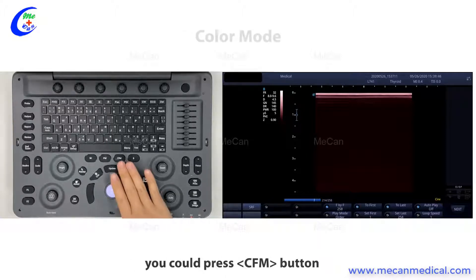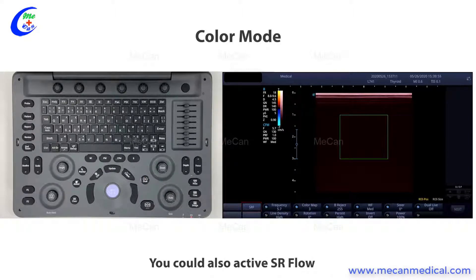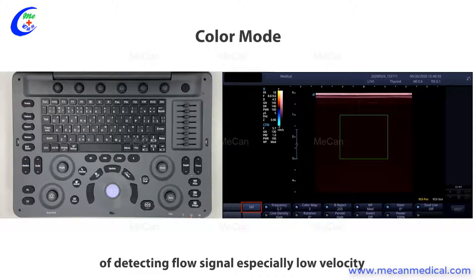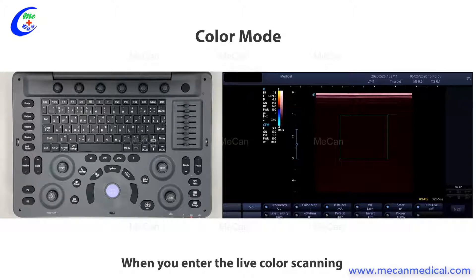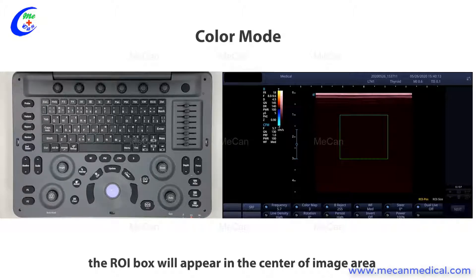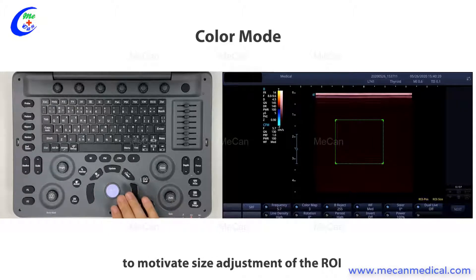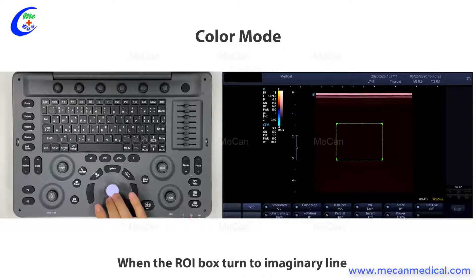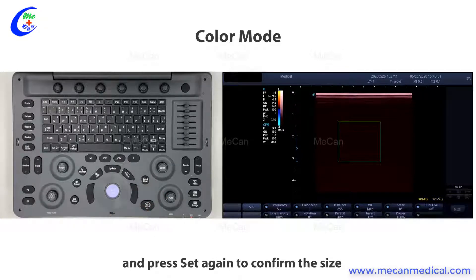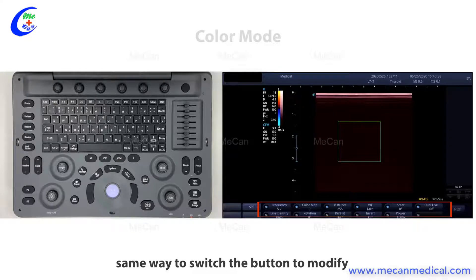After finishing the B-mode scanning, press the CFM button above the central control area to switch to color mode scanning. You can also activate SR Flow via key function to improve the capability of detecting flow signals, especially low velocity ones. When you enter the live color scanning, the ROI box will appear in the center of the image area. Move the trackball to change the position, and press SET beside the trackball to activate size adjustment of the ROI. When the ROI box turns to a dashed line, move the trackball to adjust the size, then press SET again to confirm. Parameters for color mode are displayed as well, using the same method to modify.